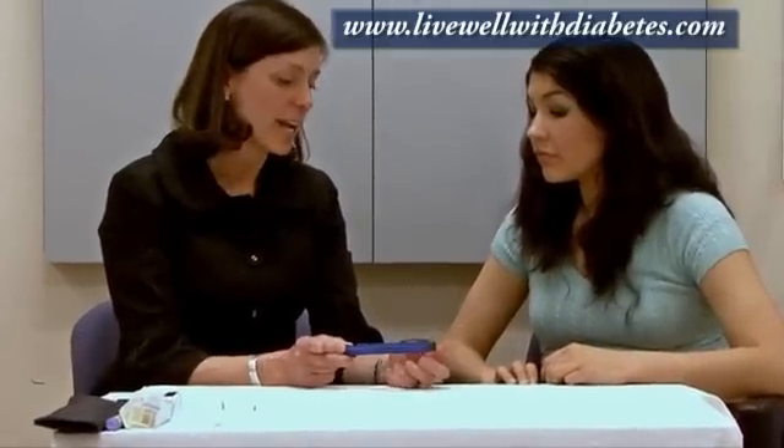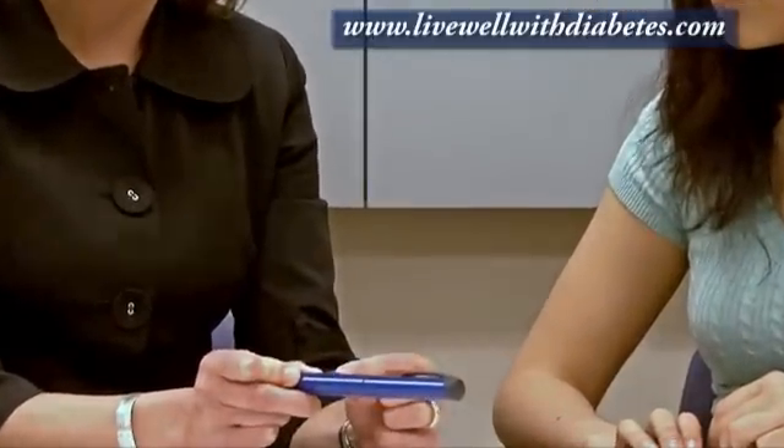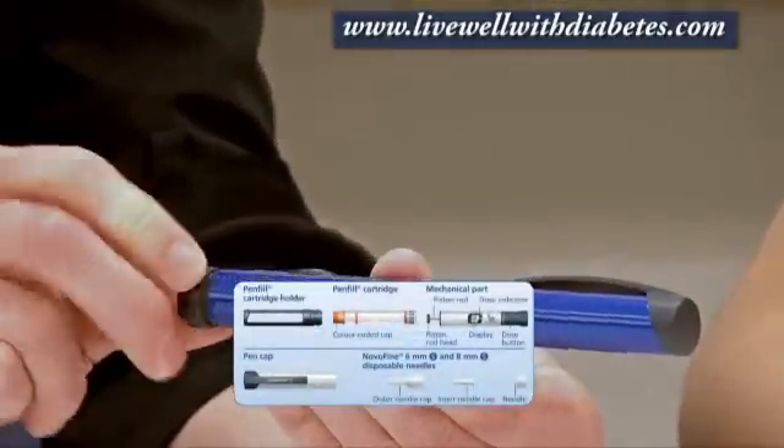This is one of the insulin pens called the NovLin Pen 4, and it looks just like a pen. It's got a cap on one end, a dose indicator window in the middle, and on this end is a dial.